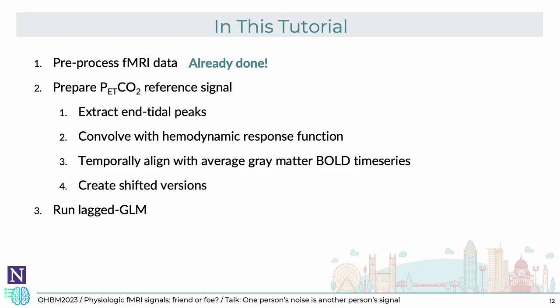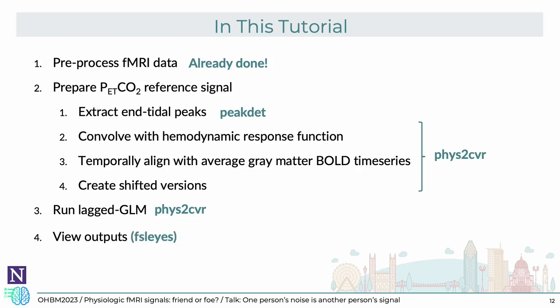The data that will be used in this tutorial can be downloaded from the Open Science Framework at this link, and the folder that it's in is listed as well. The data has been saved in BIDS format, as Mary Miedema demonstrates in her tutorial for this course. Our sample dataset is from one healthy adult participant on a 3T MRI.